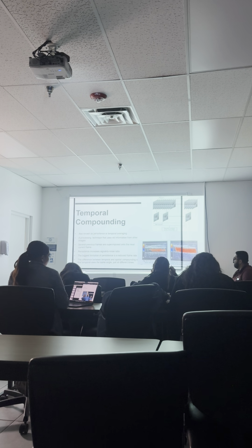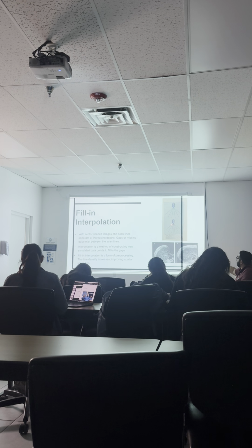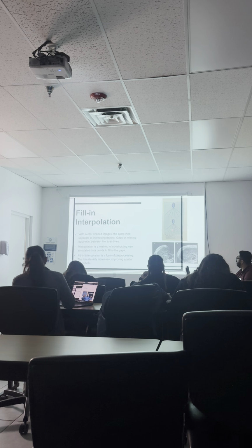Yes, very good. Next, and lastly, we have fill-in interpolation. So from here to here, what is this? We have a north and a south. It's a line of information. It's a pole, right? So fill-in interpolation: we're filling in the spaces between poles.